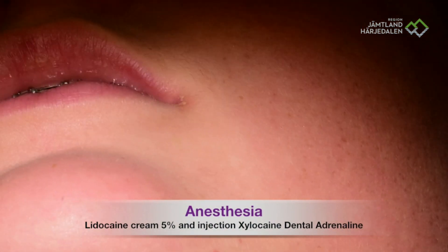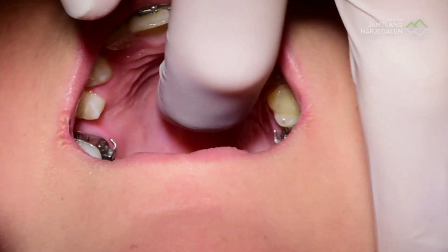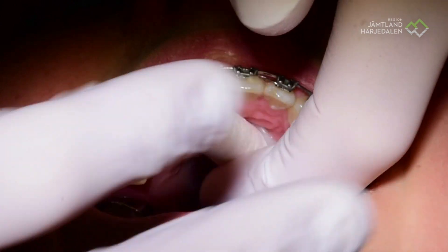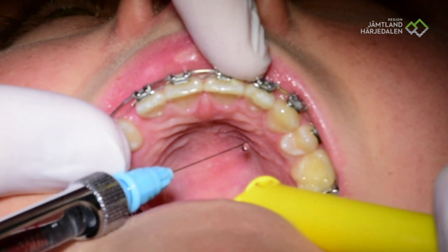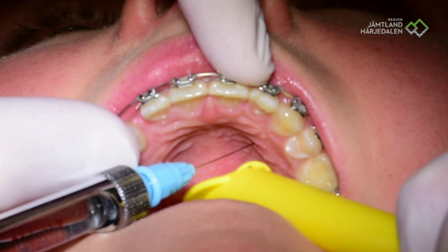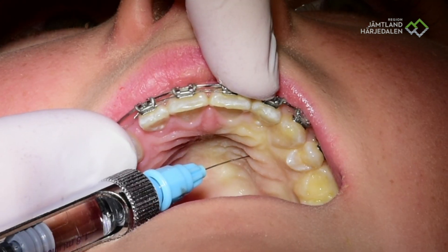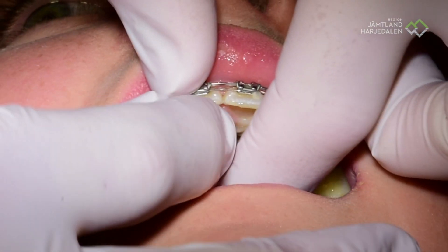Did you try anesthesia on the palate before? What we are doing now is putting local anesthesia. Open your mouth — I'll take a look. Oh, very nice, you have a very beautiful palate. I will come here and do it very slowly. The first three seconds you will feel a little bit, and then it will be fine. Now we will put exactly the same on the right side, and then we will be finished with the anesthesia.